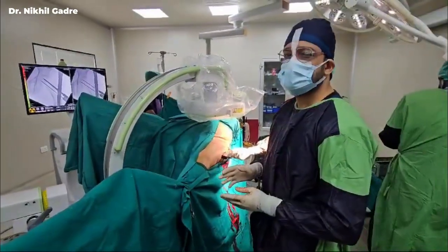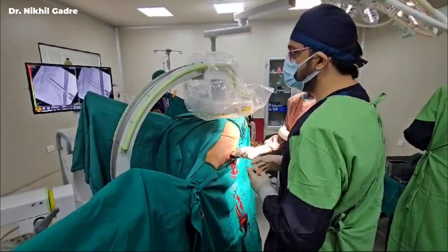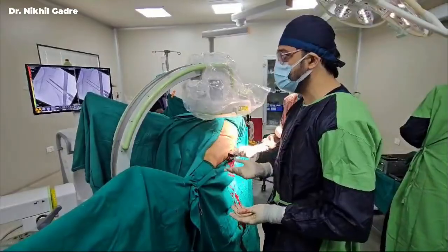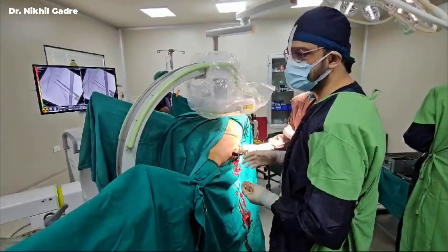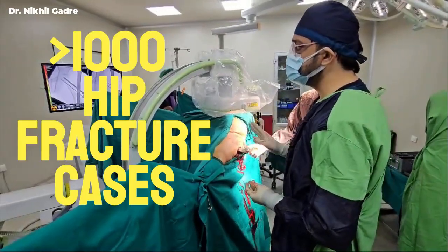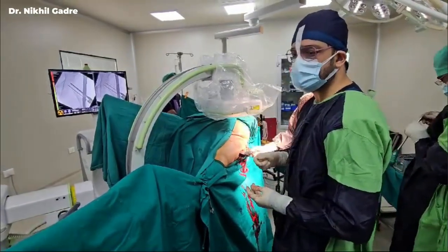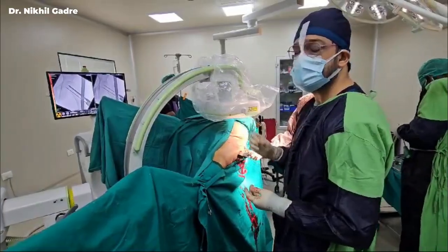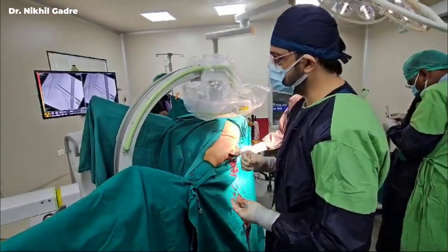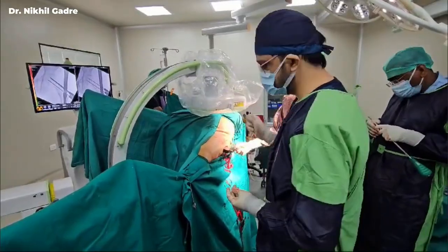There is a big debate about which screw should be put first. There are theories and debates for and against, but personally what has given me good results over more than 1,000 hip fracture cases is putting the derotation screw first, which provides good rotational stability to the proximal fragment in case of comminuted neck and intertrochanteric fractures. And I put the primary stability screw, the inferior screw, after I put the derotation screw.